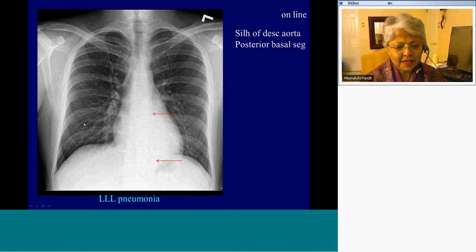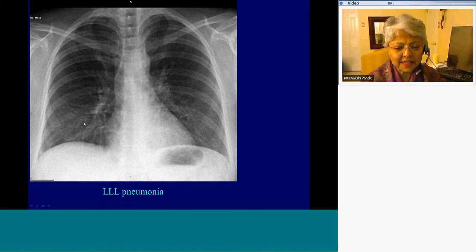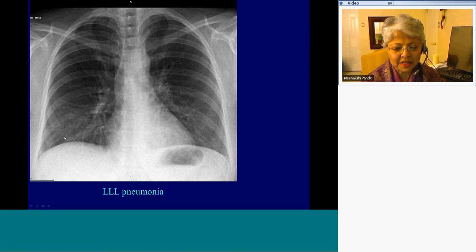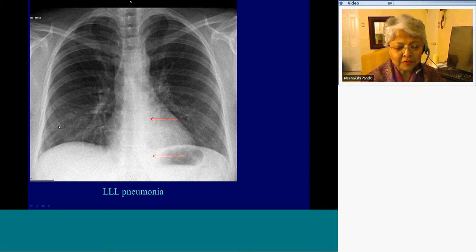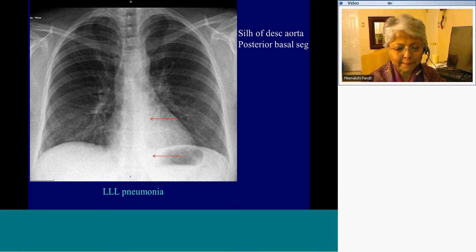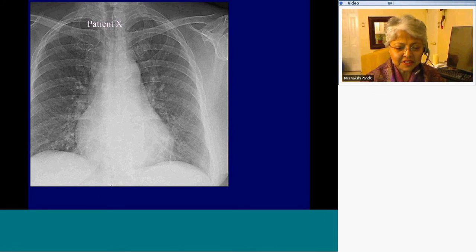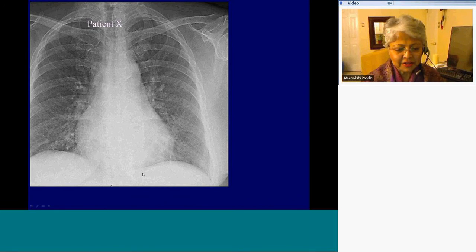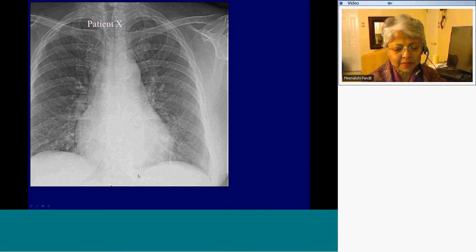This is right lower lobe pneumonia — an example of asymmetric density of the posterior basal segments in the paraspinal region with silhouetting of the descending thoracic aorta. In a speed reading, you would probably call it normal, but this is a patient with lower lobe pneumonia. This is a very subtle example where we see vagaries in density — asymmetric density of the paraspinal posterior basal segments.